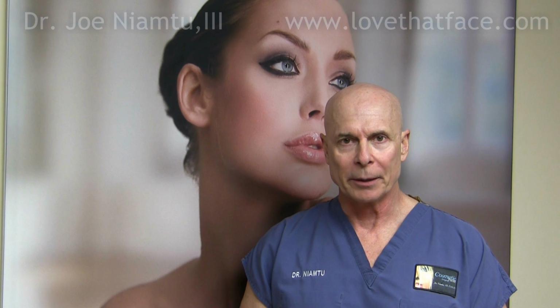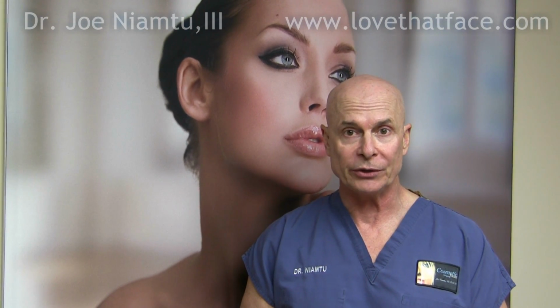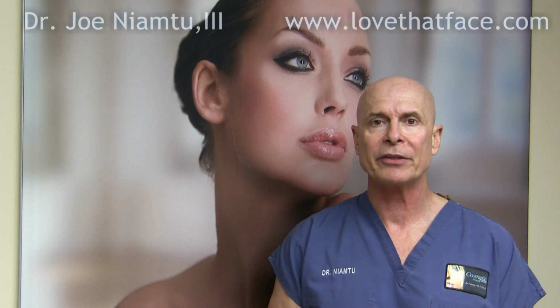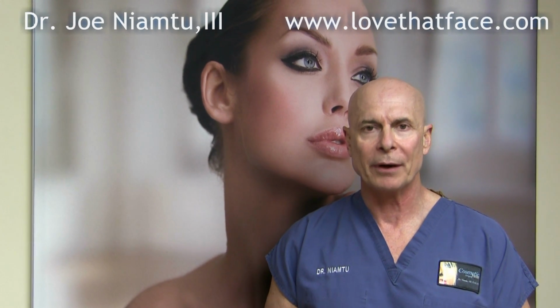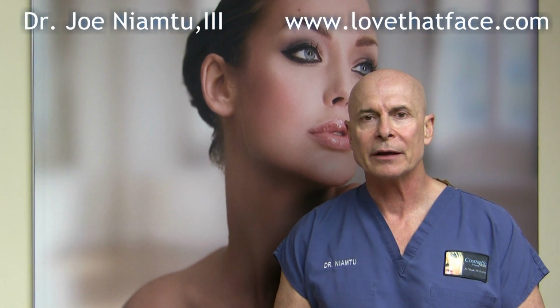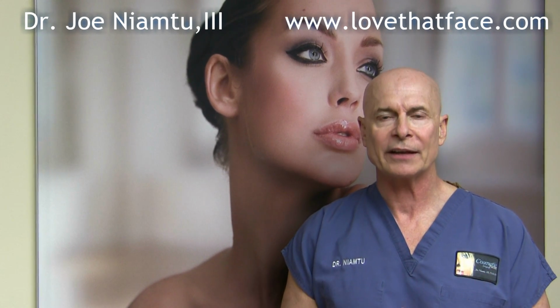We're going to talk about lip reduction today, and by and large, the majority of the cases we do are on African American patients. However, there are a lot of other types of patients that do want their lips smaller, and today we're going to do a lip reduction on the lower lip of a Caucasian patient. Everything is the same. It really does not matter what race someone is. It's all about removing the excess tissue.